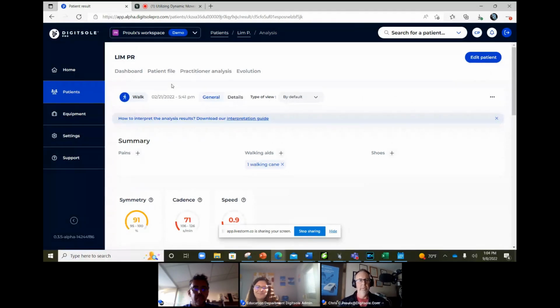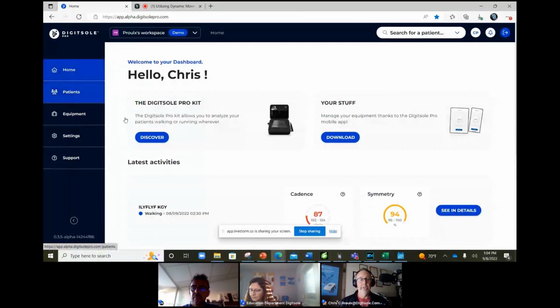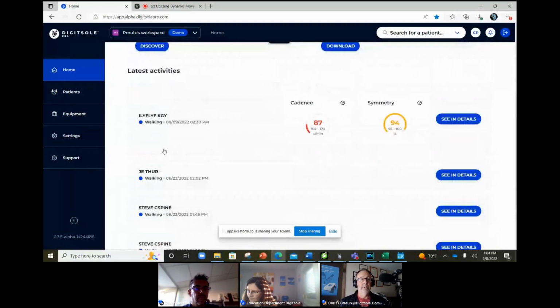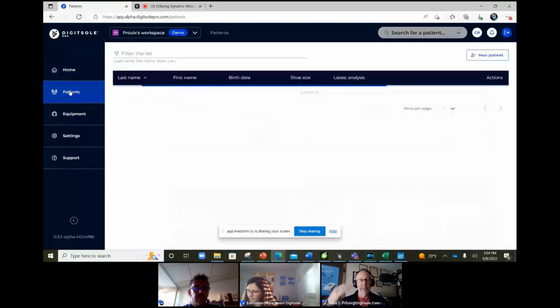Excellent. Okay. So this is the landing page, and actually I'm going to take a step back. If you're not overly familiar with this, there's what's called the landing page or your home page, which gives you some overview of information, including your latest activities. Also over here to the left, you can click on patients, and it will give you a list of all of your patients.